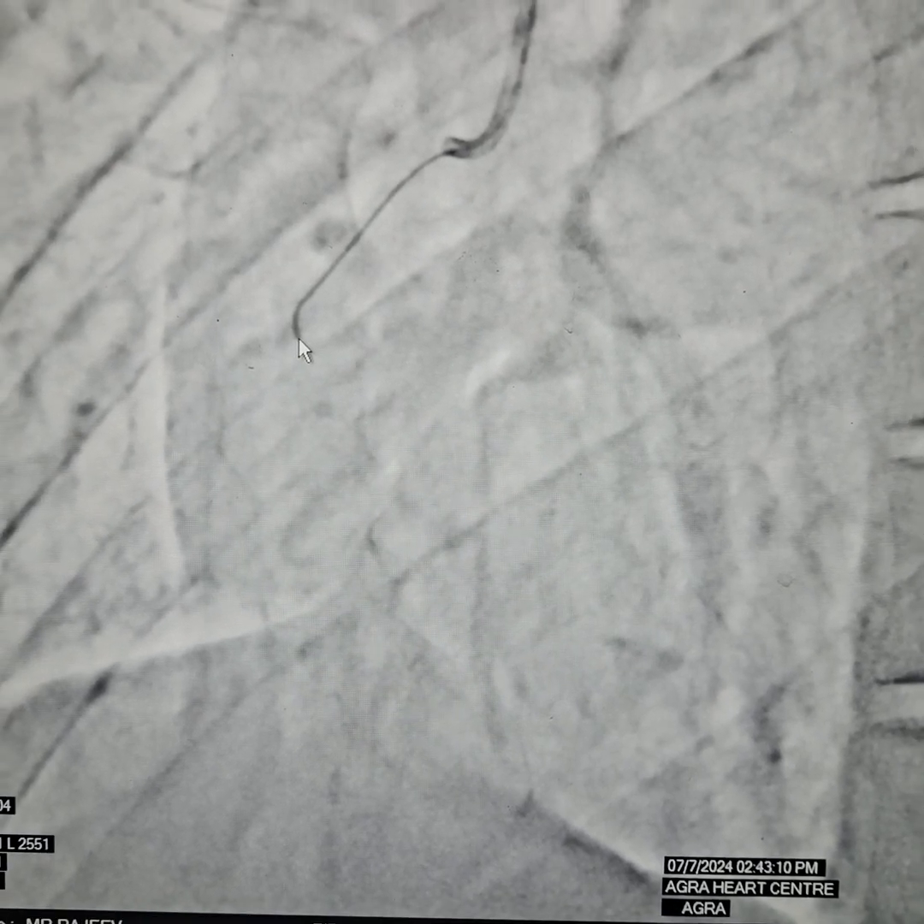We started the wiring. This is a JR 3.5 French catheter. This is the Whisper wire — we took a Whisper ES extra support wire. It has a blunt tip; it does not have a tapered tip like the Fielder XT wire. It has somewhat moderate strength or tip weight. We are going slowly, slowly and drilling, and we can see a faint outline shown here.